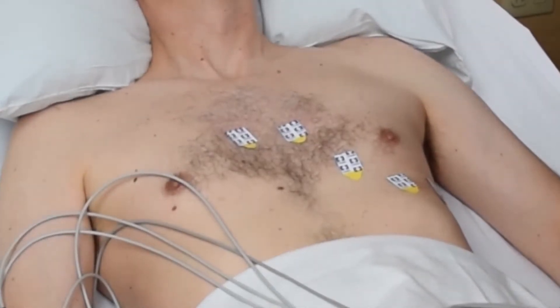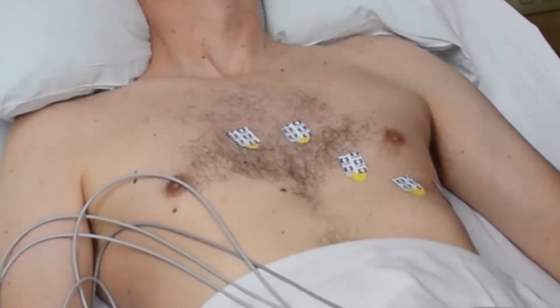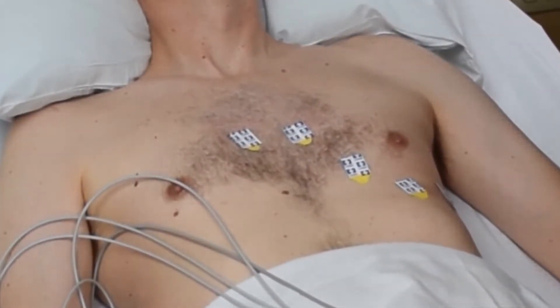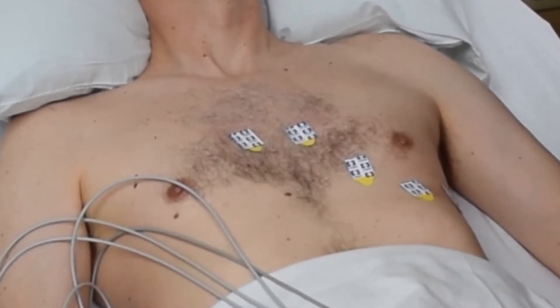You should note that when placing electrodes on a patient, the chest should be shaved prior to electrode placement in order to get good contact.